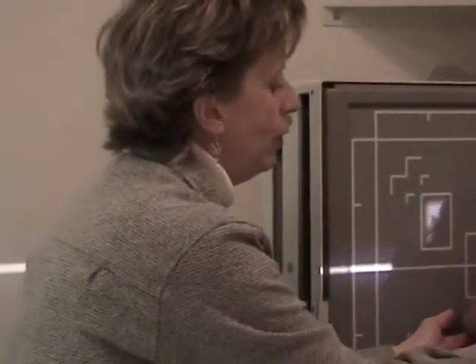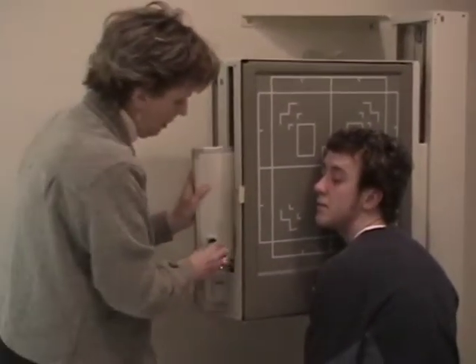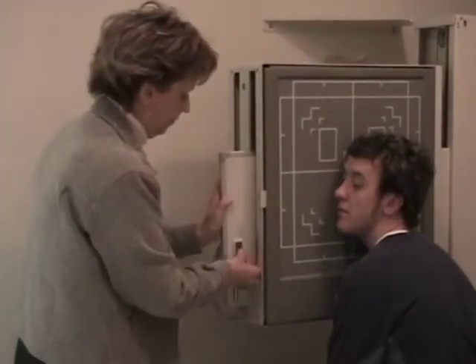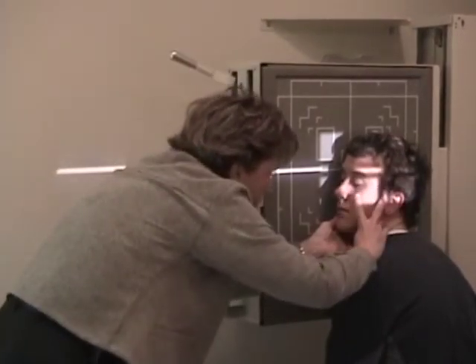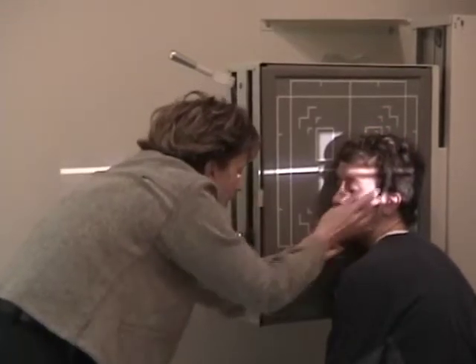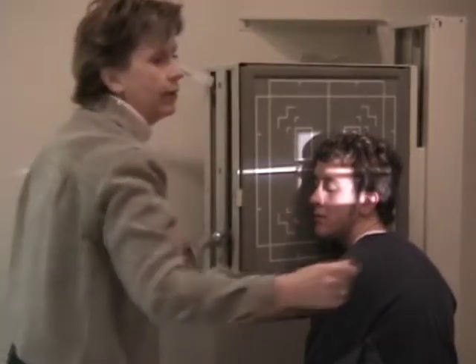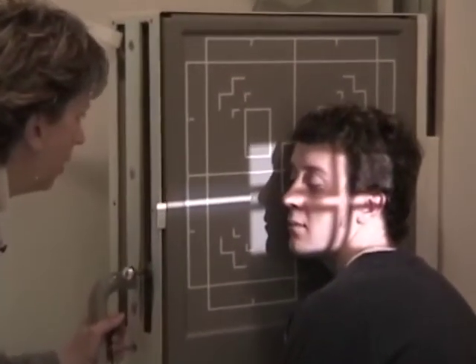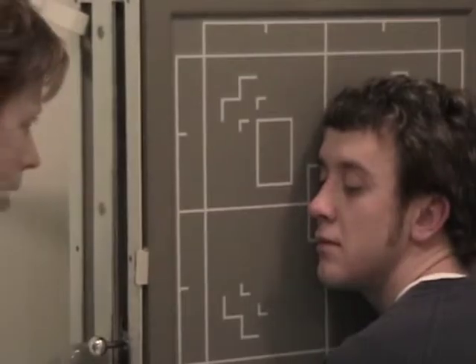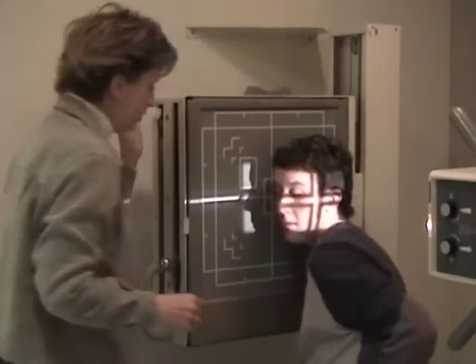Your lateral again would be whichever lateral was the injury side. Today we'll do a right. So I must change the marker. Infraorbital meatal line parallel. Interpupillary line perpendicular. And MSP parallel. Central ray is going to be at the level of the zygoma. And that would be your lateral for a zygoma. And then we're going to turn the patient around.